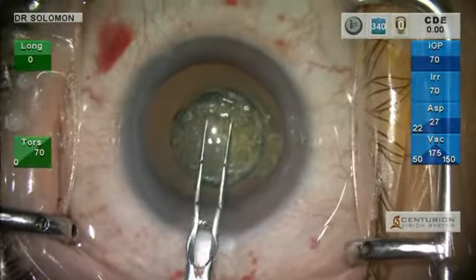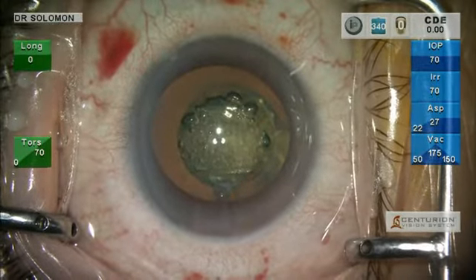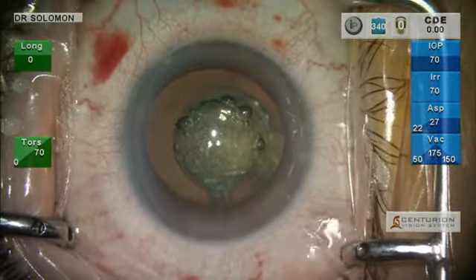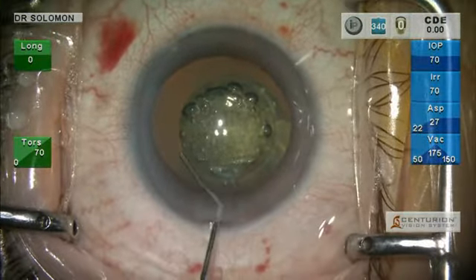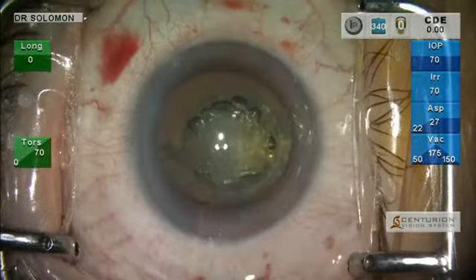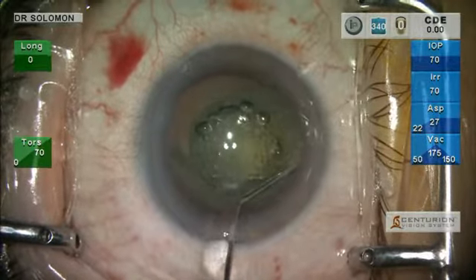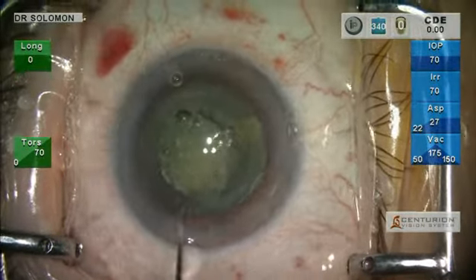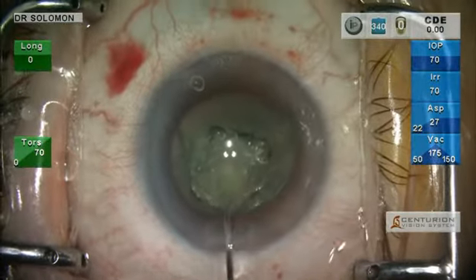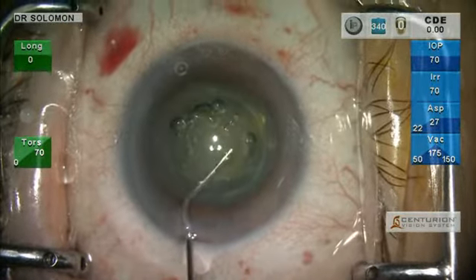We're going to remove our anterior lens capsule. Hydrodissection. We have a matrix pattern of cubes in the central 4.8 millimeters of the lens — we've limited it to that 4.8 millimeter area, which is the densest portion of the lens, and it allows excellent visualization of the capsular opening.